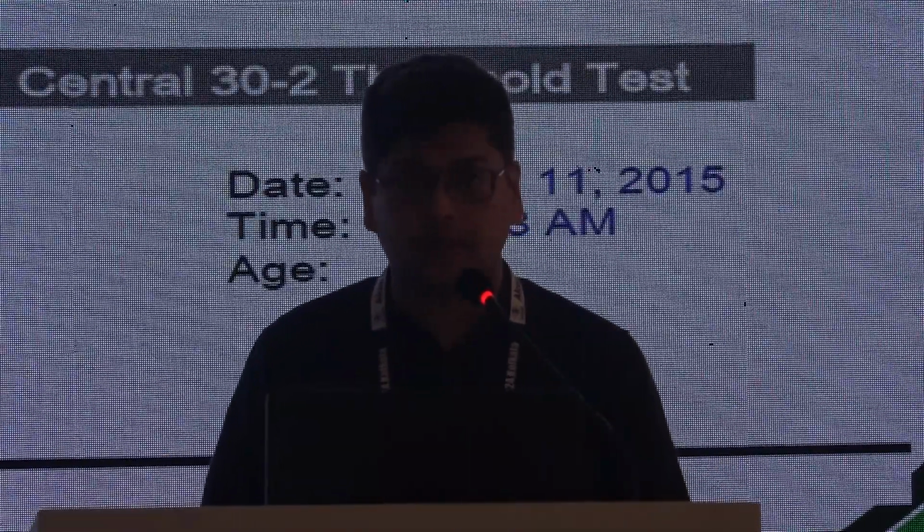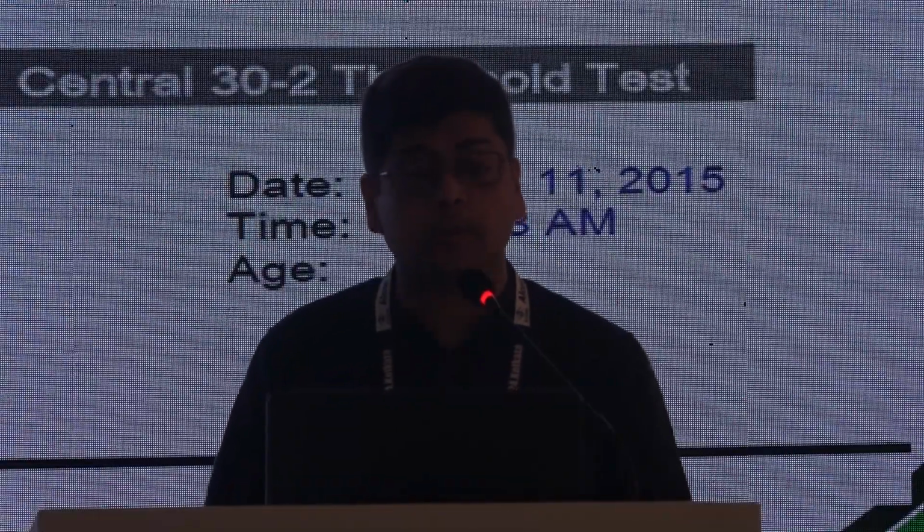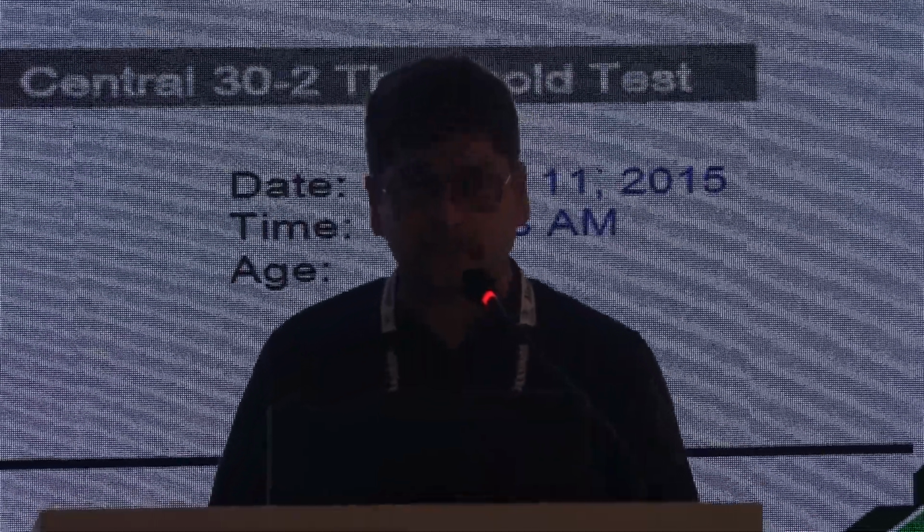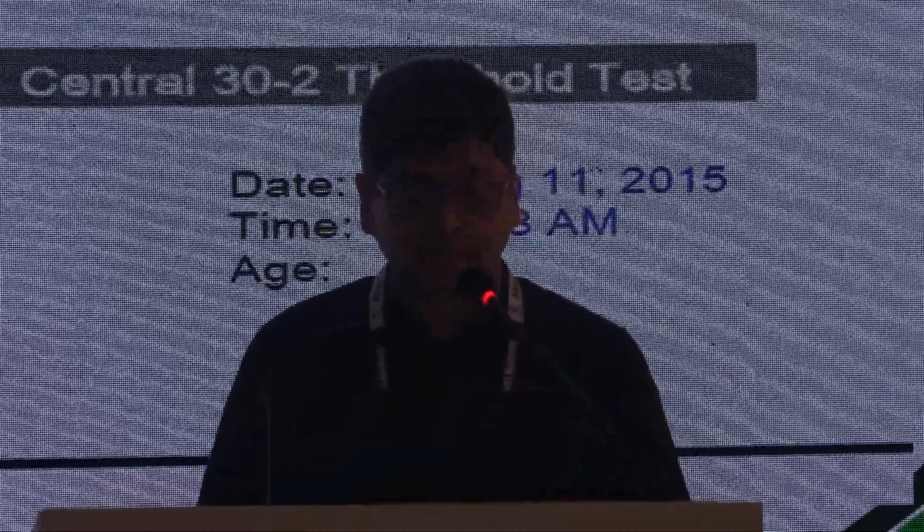This is how a single field print analysis looks like, and for ease of interpretation, we divide it into 10 zones. The first zone is the patient data and test data. The name of the patient and the age should be correctly entered, and the testing condition should be proper with a proper pupillary diameter of at least 3 millimeters. And the refractive error of the patient should be correctly entered. The correct lenses should be provided to the patient so that we don't make errors during the test.